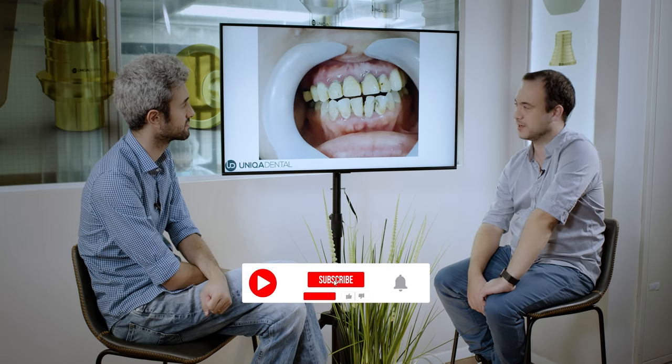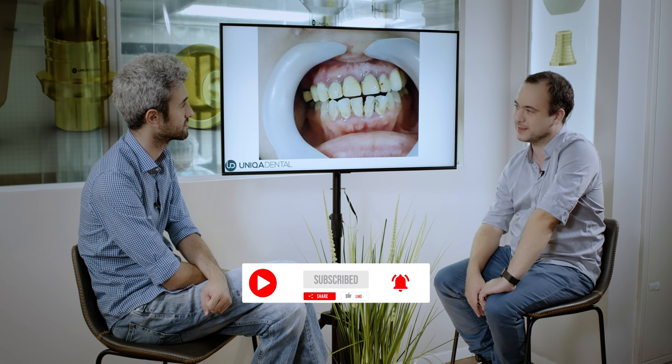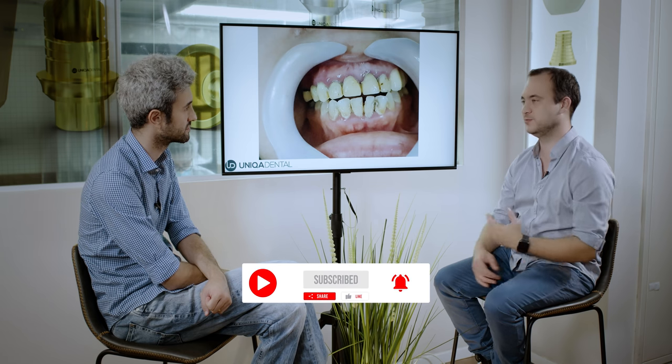With us today as always, Dr. Reniv. Today we have a case where we'll make a zirconia restoration bridge on the upper jaw. We'll extract some of the teeth, then we'll have a temporary bridge on the teeth we left, and later on we'll change the provisional bridge to a zirconia bridge on top of those implants.